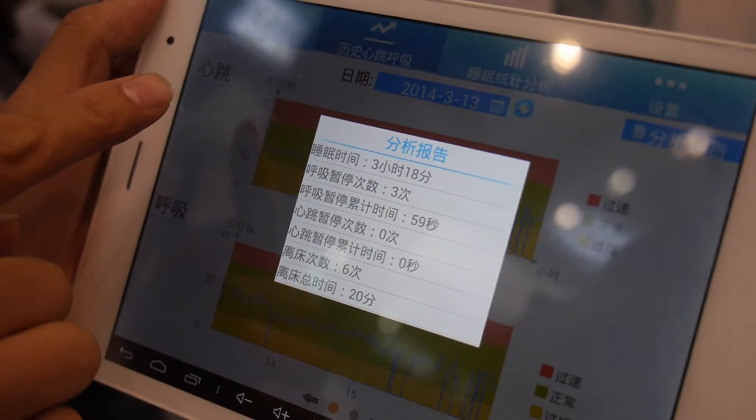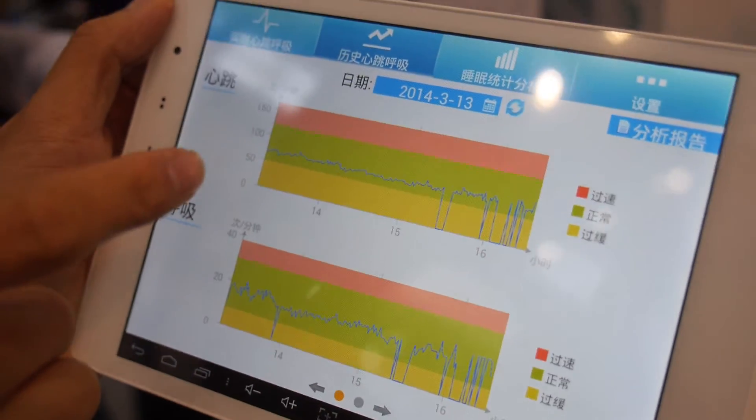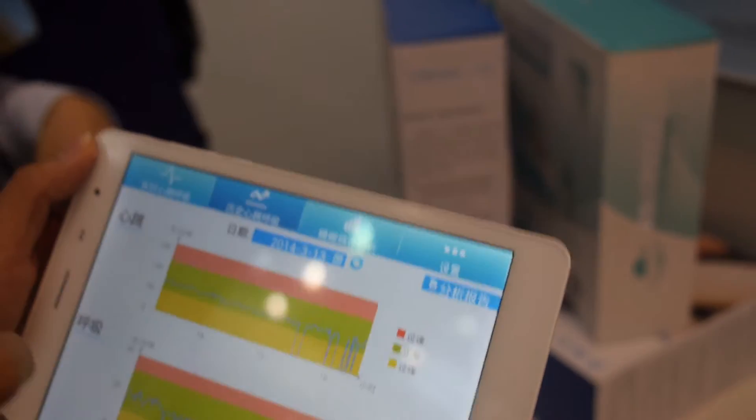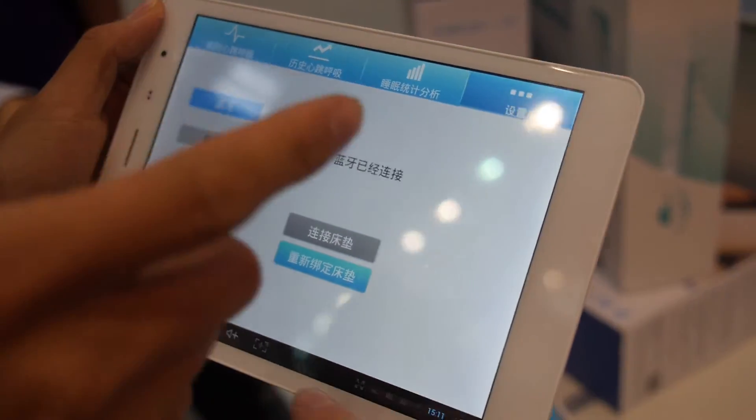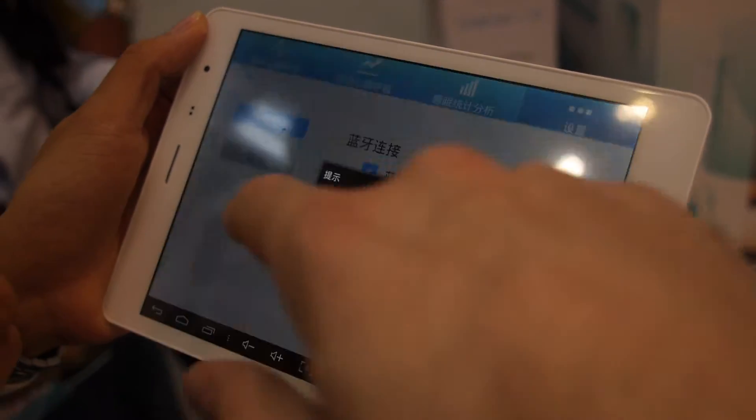We have an English version, but right now we need to install a separate version to switch — you cannot change to English in the current app. So there are English and Chinese versions.